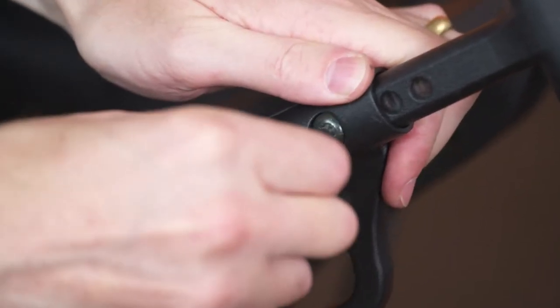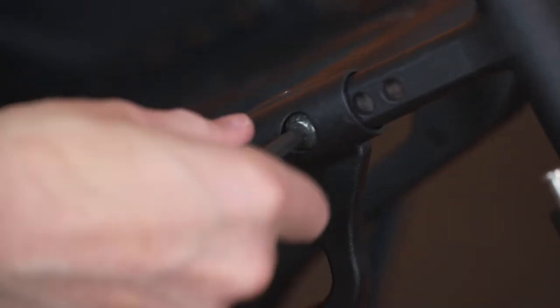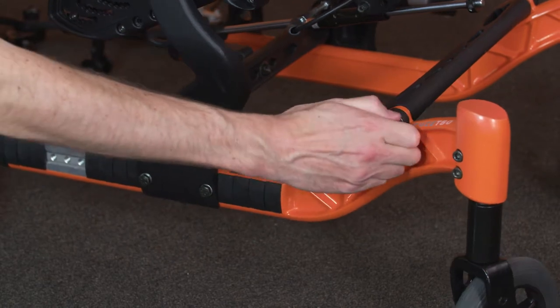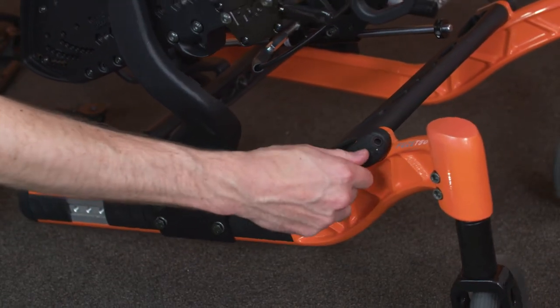Note the position of the front rigging receiver if fitted. Fit the required spacer to the exposed end of the crossbars. Each spacer will add one half inch to the width of the wheelchair.